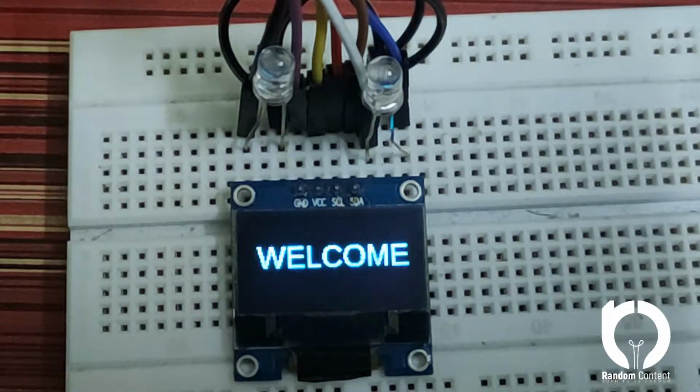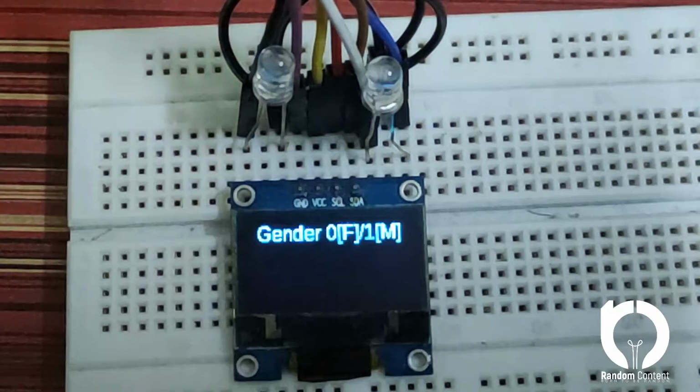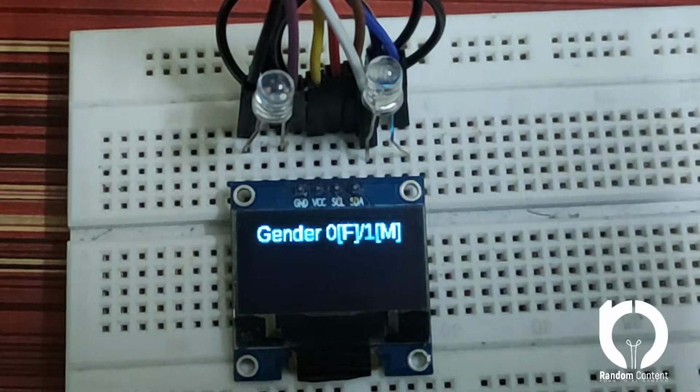It is turned on. You may see a few flickering in the screen because of the refresh rate of the camera. Now it will ask for gender. I'll first show you the example for not anemic.